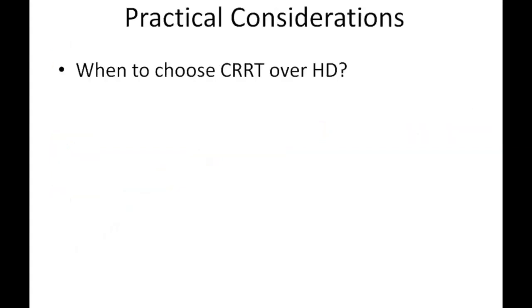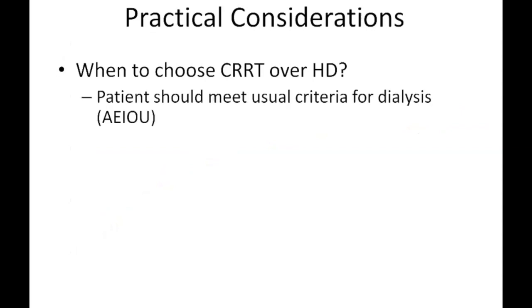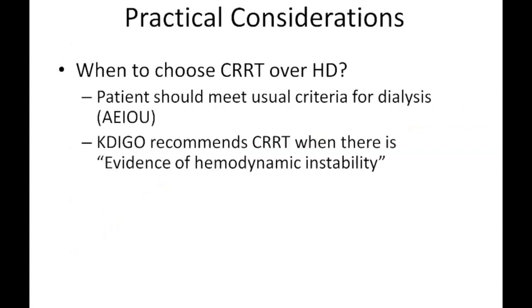So, when would you choose one modality over the other? Well, first of all, obviously the patient should meet criteria for dialysis, and that O for volume overload is more and more being found to be important. And so we're starting dialysis often a little bit earlier than we might just for the labs in order to manage volume overload and hopefully wean patients from ventilators sooner.